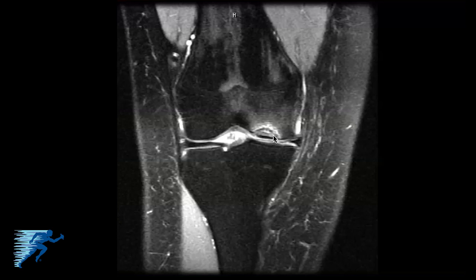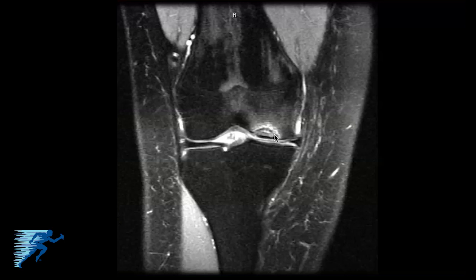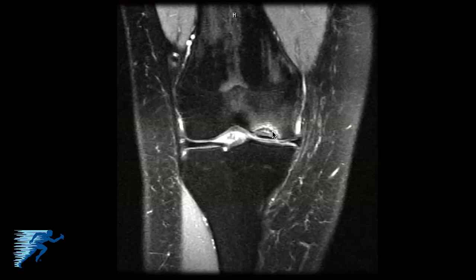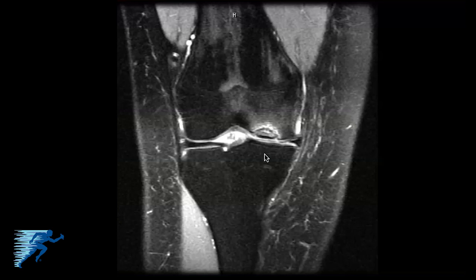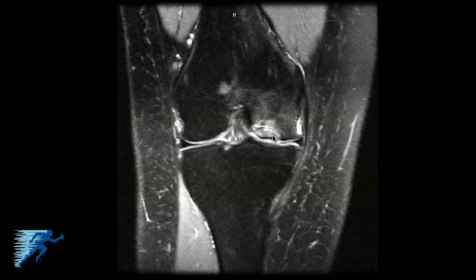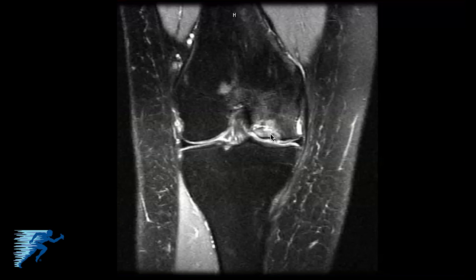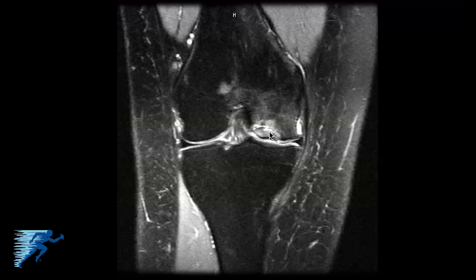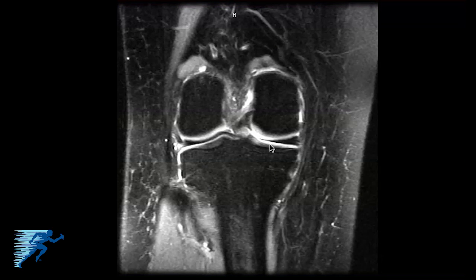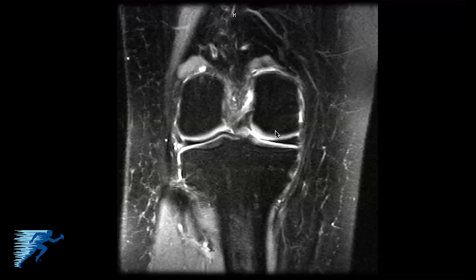In this case, there are some cystic changes deep to the OCD lesion, as well as some generalized swelling in the rim that forms around it. The OCD lesion is still intact here, but just barely, because we can see some fluid between the margins of the bone deeper under the lesion. As we get more posterior, we can see the more normal appearance of the medial femoral condyle.